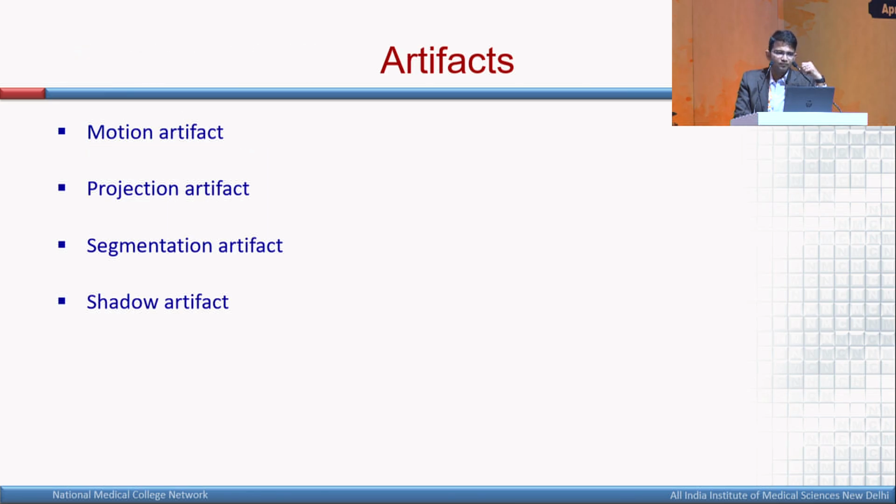And last, which is an important benefit over fluorescein angiography, is that you can perform a quantitative assessment of the vasculature as well. Now, important here is that you need to know the artifacts which could occur with OCT angiography, and you need to interpret accordingly and take care of all these artifacts before you come to a conclusion.